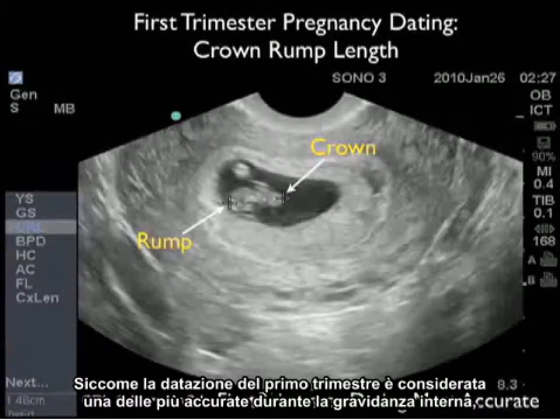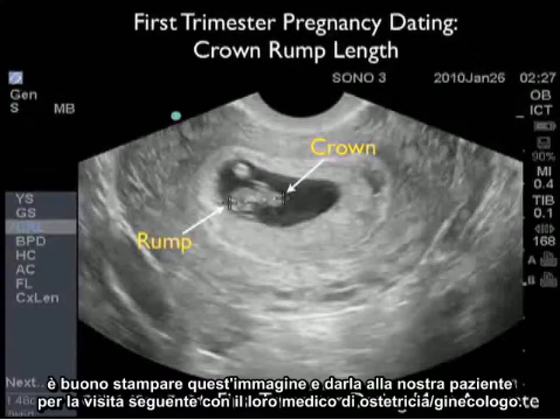As first trimester dating is considered one of the most accurate during the entire pregnancy, it's nice to print this image out and give to your patient to take for their follow-up visit with their OBGYN.